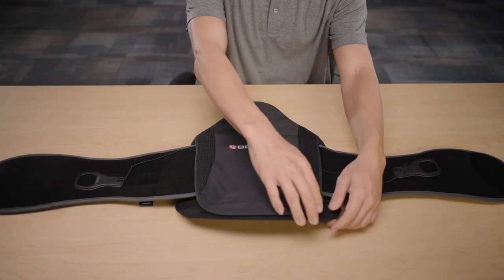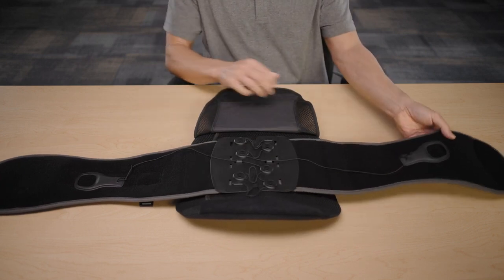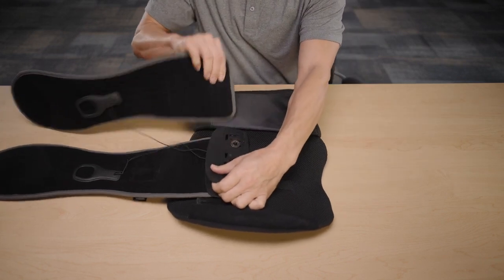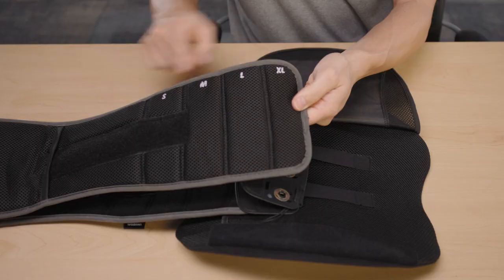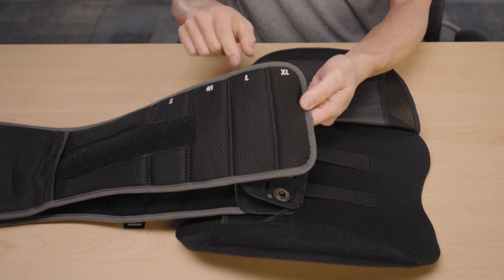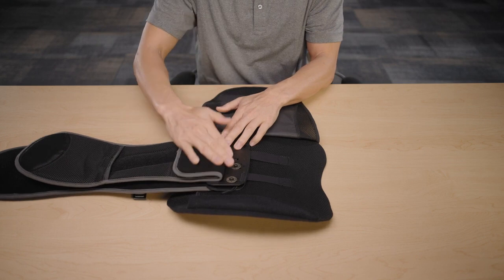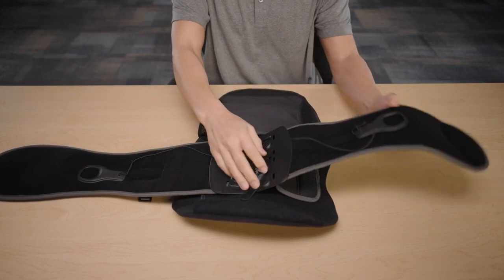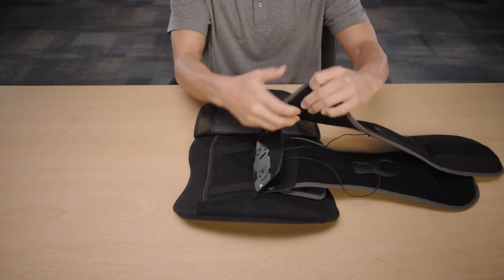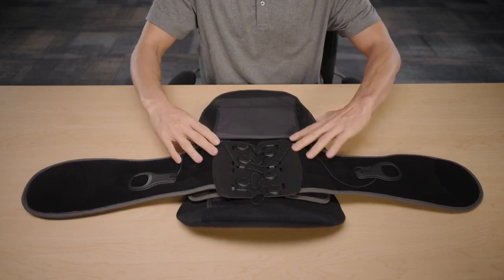Start with the back of the belt facing you, then open the back cover and remove the belt from the back plate. The belt is marked with sizes for small through extra-large. In this example, we're changing the size to medium. Adjust the belt by folding the belt end to the appropriate size, then reattach the belt to the back plate. Repeat these steps on the other end of the belt to complete the sizing process, then close the back cover.